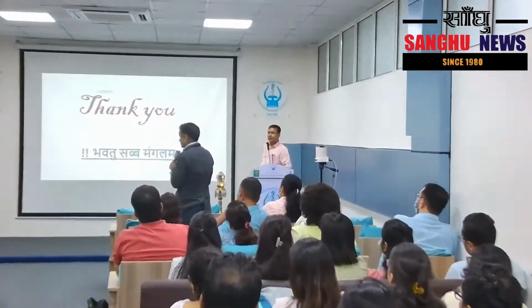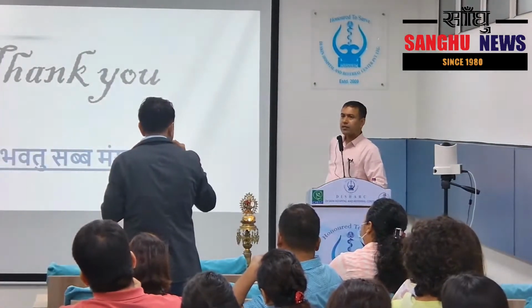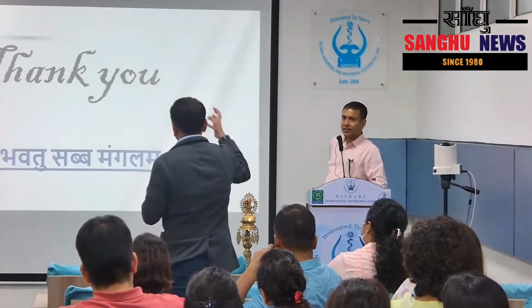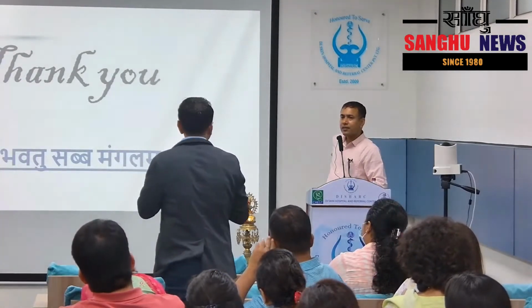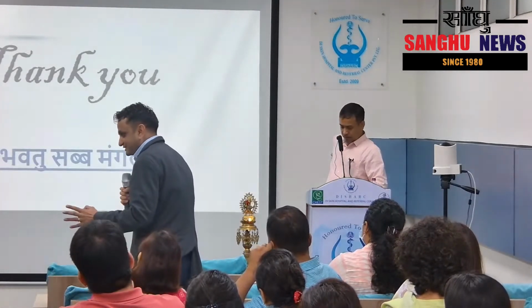The case came to me as an aggressive type of presentation. That clinical picture I had, but the microscopic picture I didn't have. I'll go with the earlier presentation. In the earlier presentation, I saw a form of erythema multiforme. I was very confused.